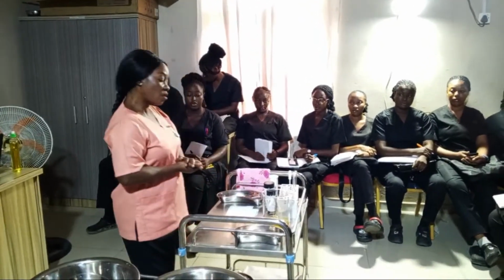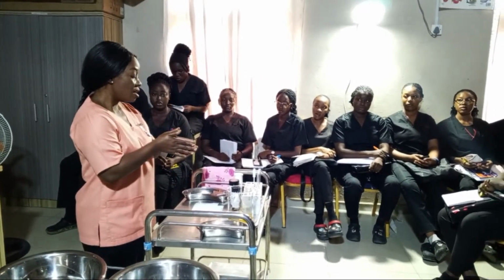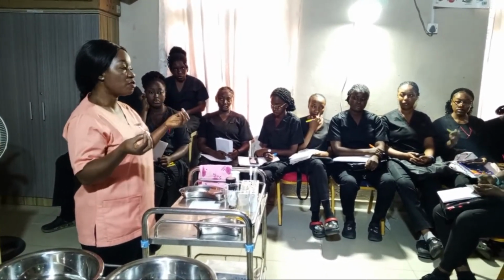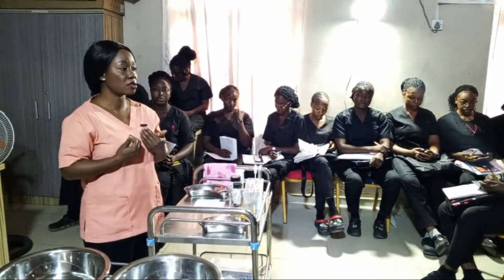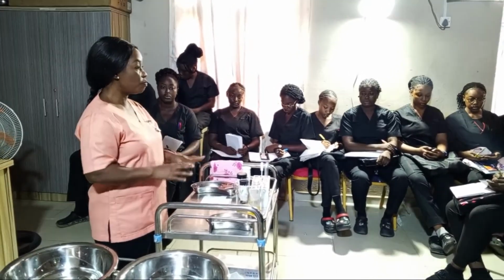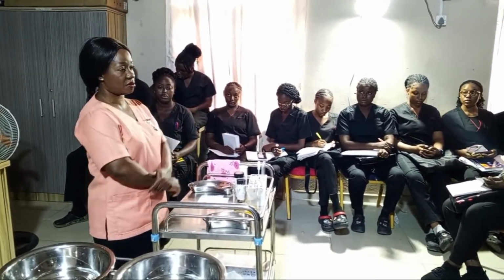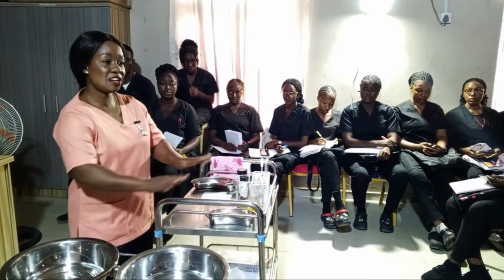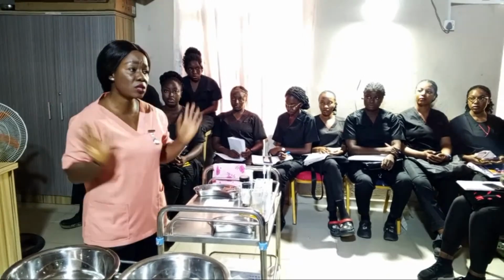All right. So the next thing now is for us to start the procedure after understanding the instruction. The instruction, for example, says I should carry out the procedure. So now I want to carry out this procedure. Remember, there is no patient here. You just have a specimen. No specimen, no patient, right? So you don't have to go and greet and introduce yourself to the patient, or take consent. No, you don't have to do that. It's a specimen before you, then you go straight.